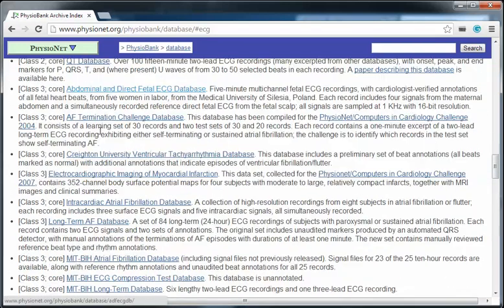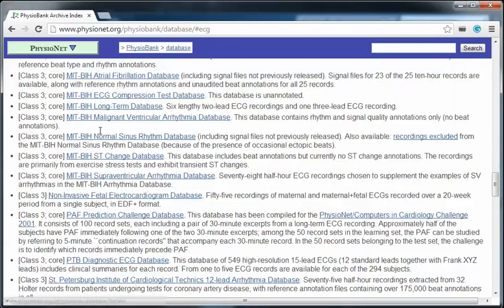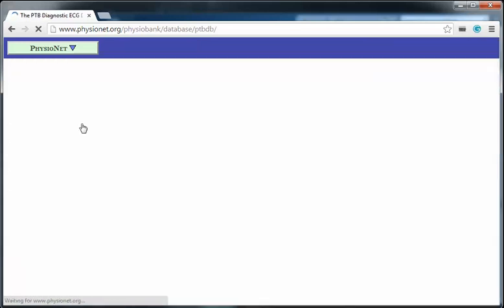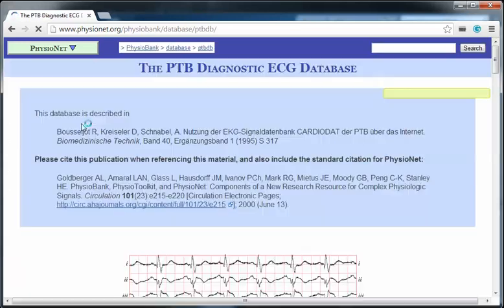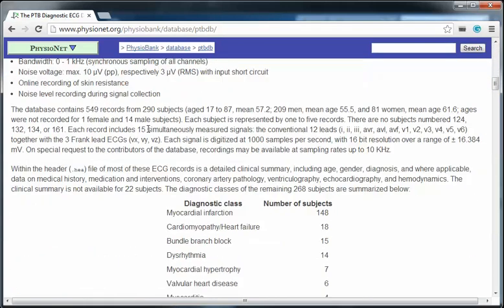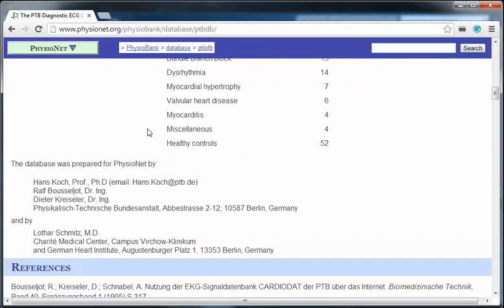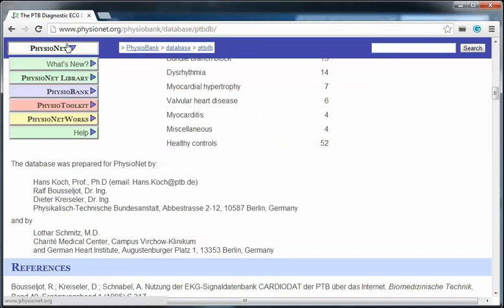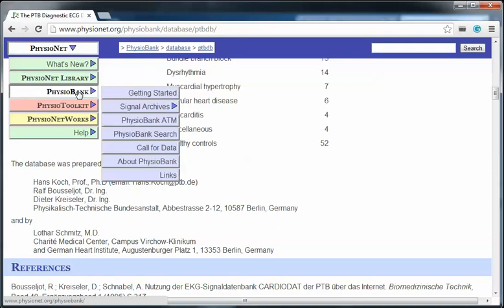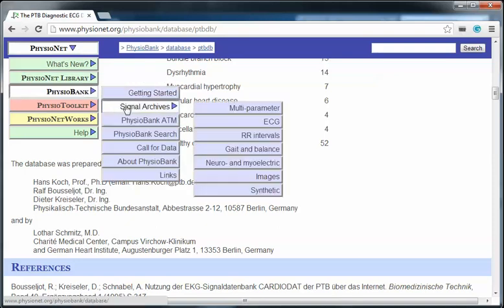Here you can see many different classes. In this case we use PTB Diagnostic ECG database. To get more information, click on it. You can read here many details about this database. To download any records, back to PhysioNet, PhysioBank.